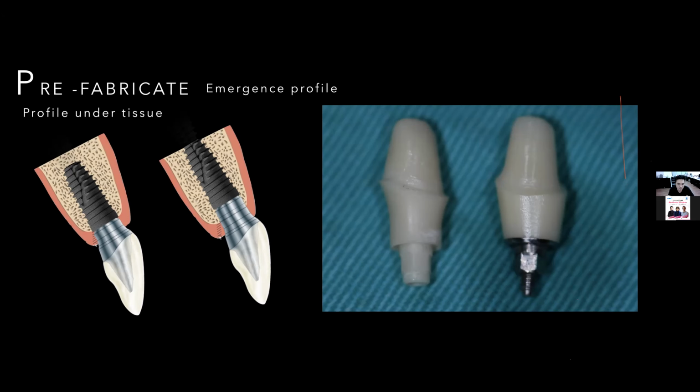So nowadays, my recommendation is, when you want to create a single implant, under the margin, maybe 1 to 1 millimeter is convex, and under that we just make it more straight, because it won't push our tissue or bone too much, and it can also give some space for our tissue, so it is easy to maintain our tissue level, and it is not easy to resorb.